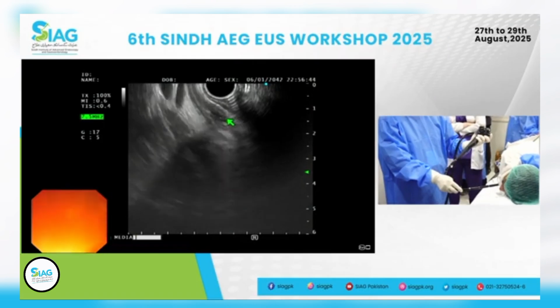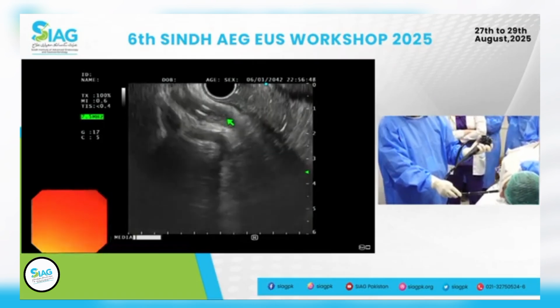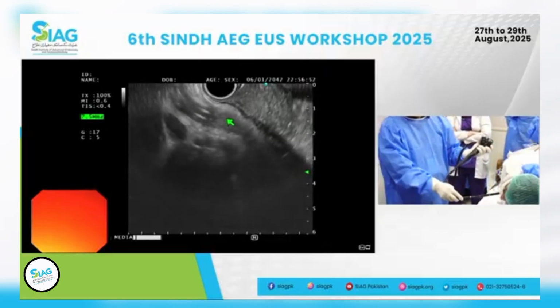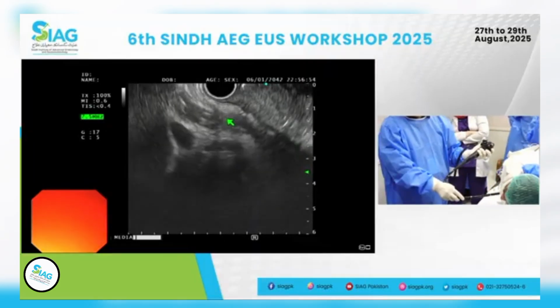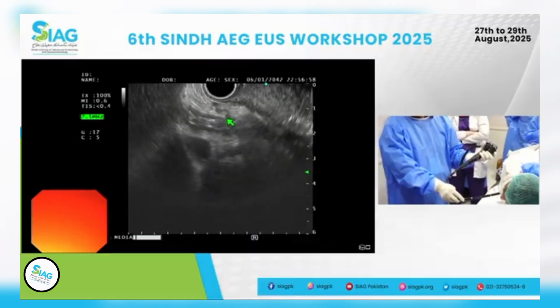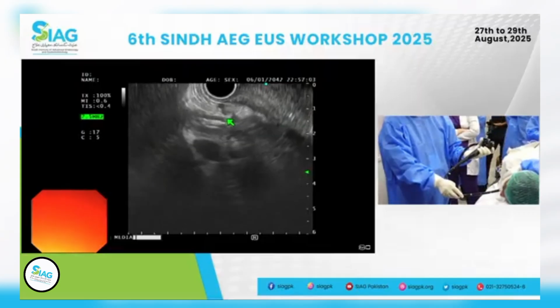Right there, big wheel away from me. You see clearly the stent, control of the scope, and gently advance the scope a little bit, moving the big wheel away from me, and that really helps me get to the liver hilum. You see the stent there?